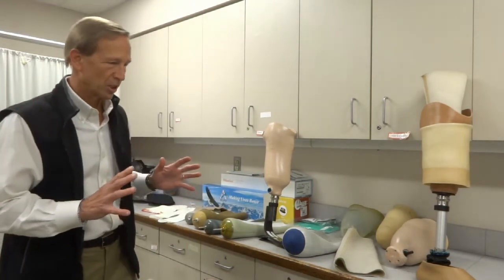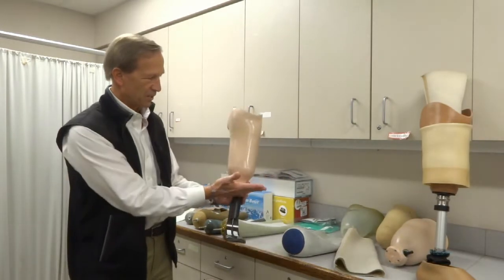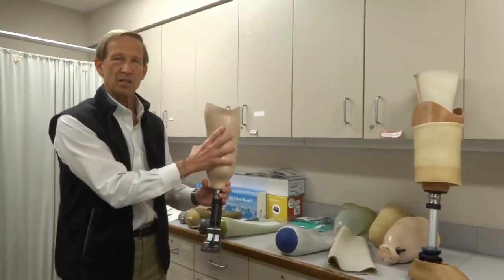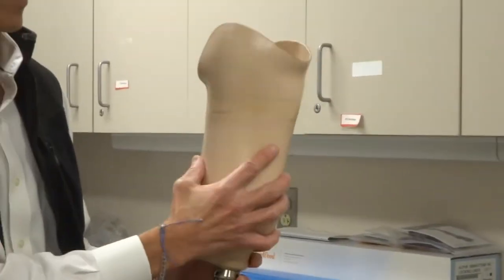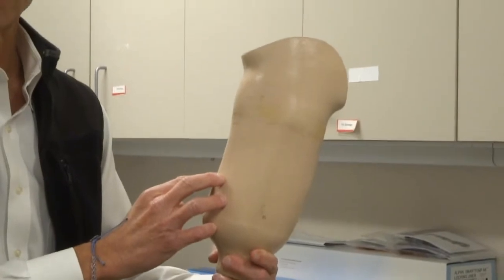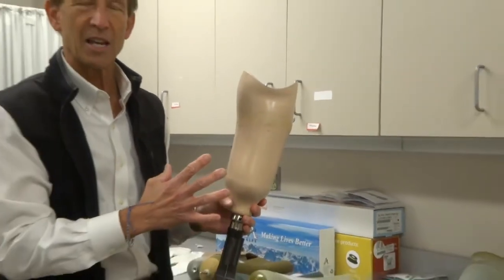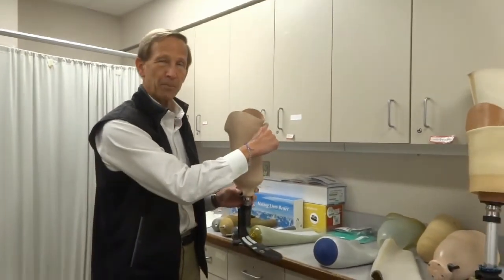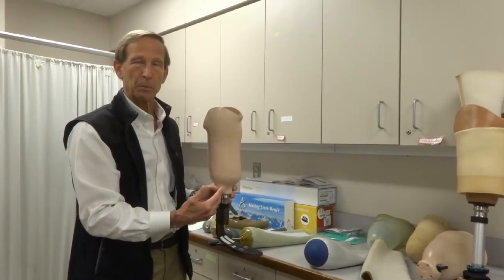Let's talk about material and what we call these things. The socket itself is this piece from the connector. This is the part that's custom-made, and you'll see that there are contours to it. It's shaped to match your limb, but it's also shaped to put more pressure in some areas and less in others. You see how there is a bump here, and that indentation should go right under your kneecap.